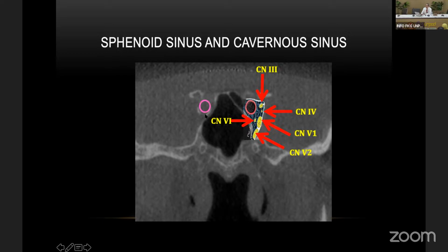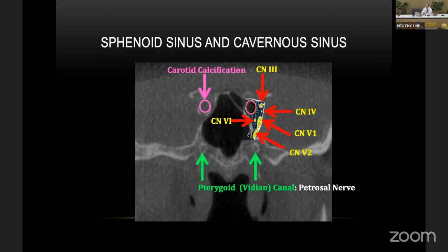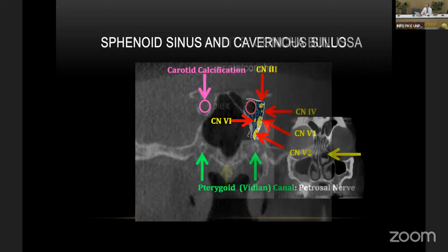Some of you have experienced taking a pano. You see the carotid calcification in the neck, but actually we can see it much more often in the skull base. So when you're looking at the cone beam CT, particularly in radiology, the residents, when you do the interpretation, you need to pay attention to the skull base, and make sure the patients have no carotid calcification there. Now, this is just a normal anatomy, like a Vidian canal or pterygoid canal.